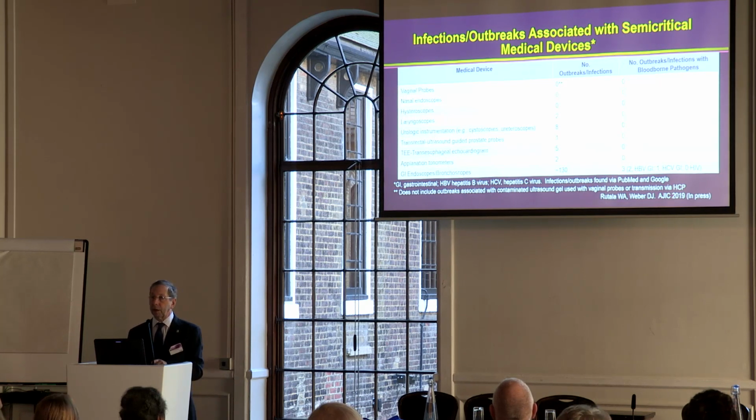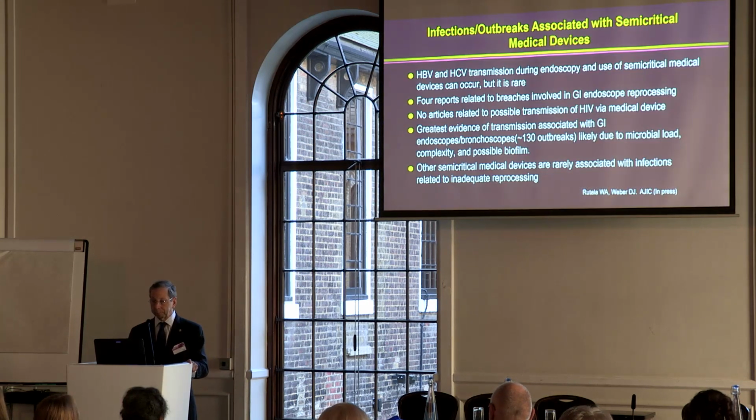And I should say for these outbreaks, you should look at these as the minimum risk, not the maximum risk, because in many of these, the patient would either get colonized with the bacteria and then weeks or months later become infected, and nobody would link it back to the semi-critical device. Or in the case of things like hepatitis B or HIV, again with an incubation period of months, linking it back to a device and proving it would be either rarely done or very difficult. So you should look at these as only the tip of the iceberg of the hazards of these devices.